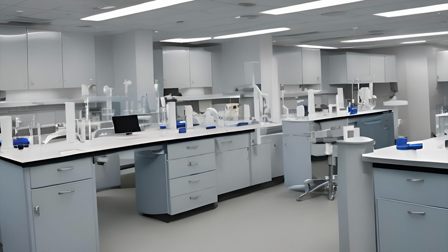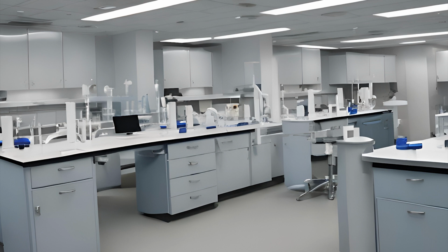A suitable specimen is required to have an accurate lab result. If someone brings you an unsuitable sample, either there's not enough of it, or it wasn't properly transported, or it was collected incorrectly, you have to reject the sample. And this is where lab techs and clinical teams often butt heads. They'll try and argue, oh, just try and run the test anyways. I know it's not right, but just try it.